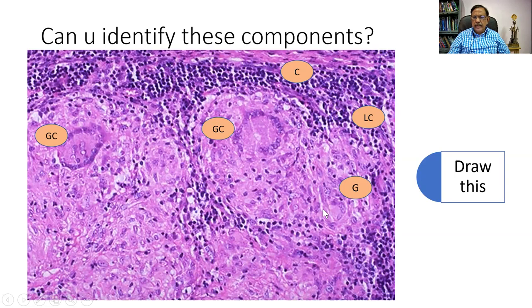Compared to the lymphocytes, I find that the cells here are all pale. And what I am pointing to will be the nucleus. These are the nuclei that I am seeing. And the surrounding area is the cytoplasm. The cytoplasm is neither bright pink nor blue. We call it amphophilic. And the nucleus is vesicular. Vesicular means it allows light to pass through. It's a vesicular nucleus. So this is a granuloma.